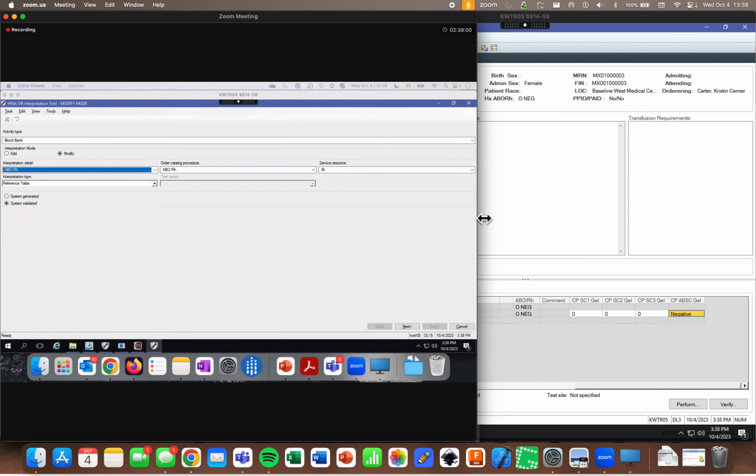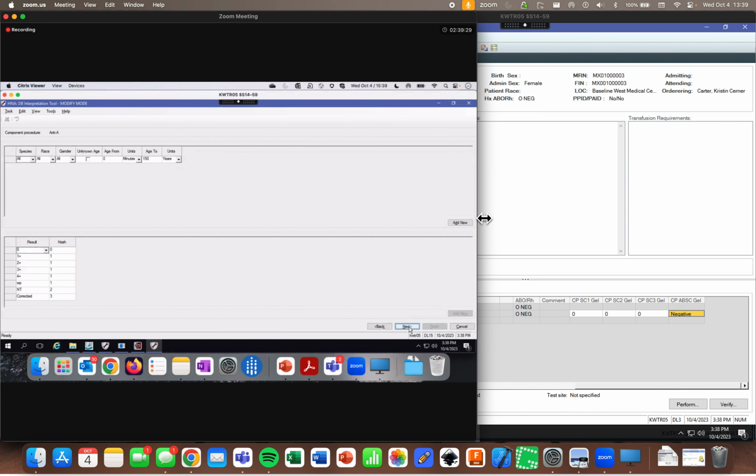I think somebody else had a question in there. No, I was just going to add mine asked for, or it didn't generate it. So I picked it and then it asked for override reason. So that means that when we were doing the interpretation tool, I must have forgotten to go to system generated instead of... No, so if it's asking you to override, it could just be like a typo or a misclick in the final pattern.